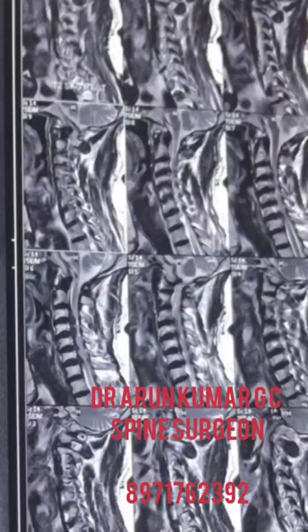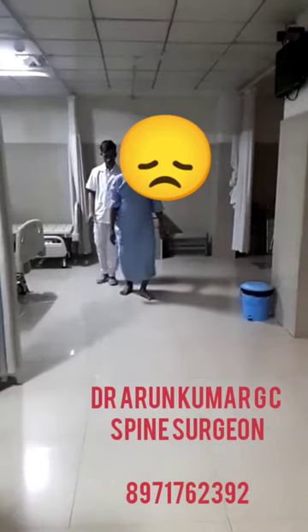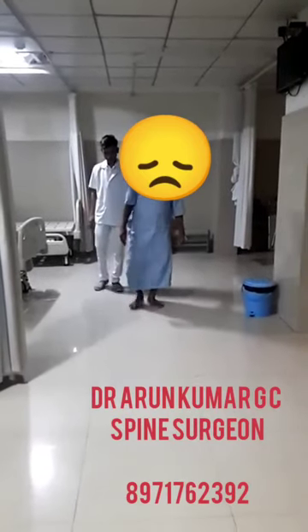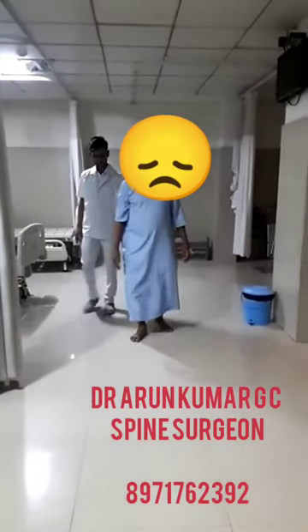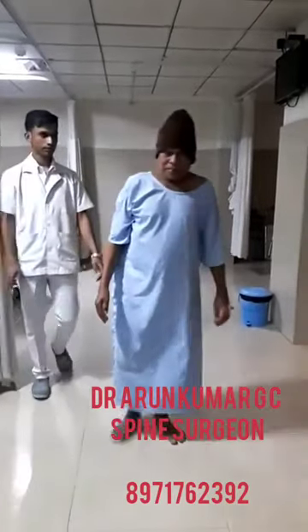These are the sagittal images and also the axial images of the cervical spine. The patient had walking imbalance, difficulty in gripping small objects in the hand, difficulty in doing fine movements, and repeated episodes.